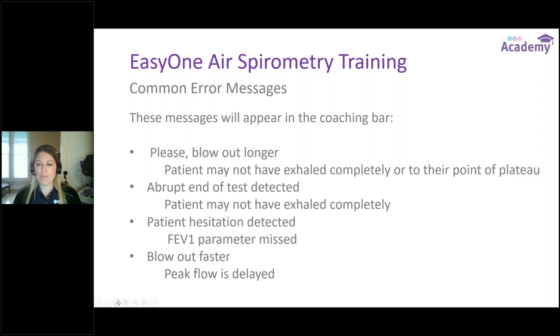Common error messages: in a perfect world, the coaching bar says good effort, due next after every trial. But sometimes patients cough or are very ill and can't perform correctly on the first try. The first common error is Please Blow Out Longer — the patient has not completely exhaled to their point of plateau; the device was still sensing air. The fix is to keep coaching them to keep blowing, even when they feel there's no air left, until the device ends the trial.